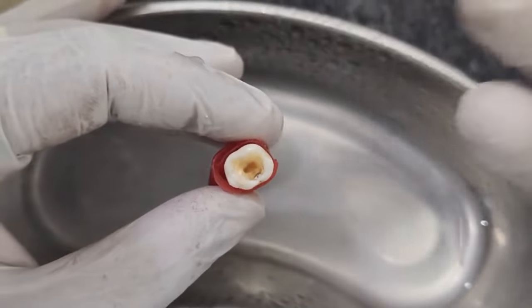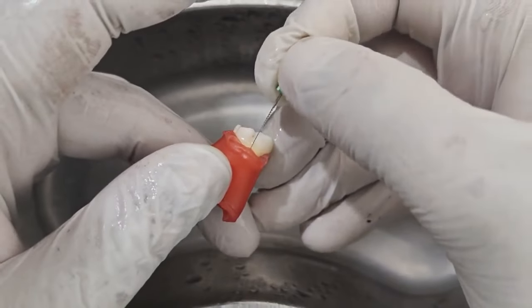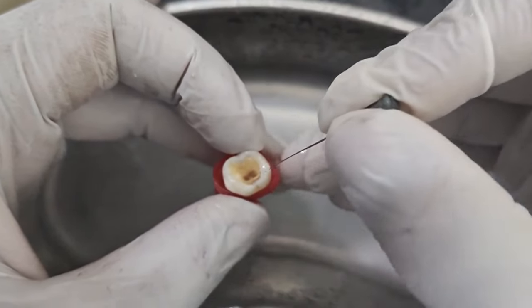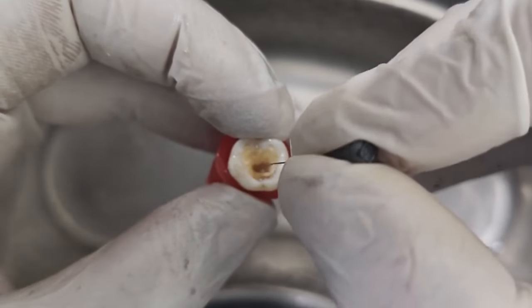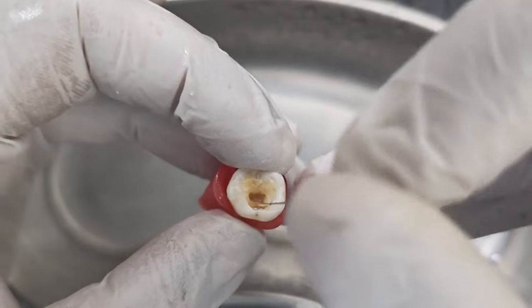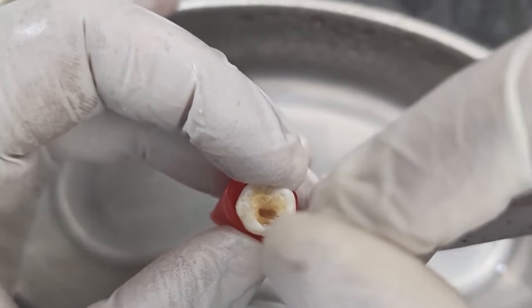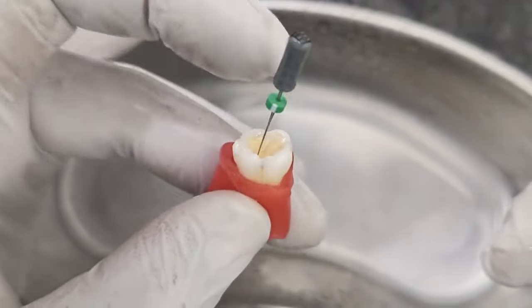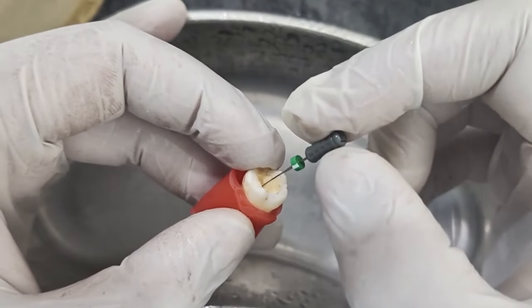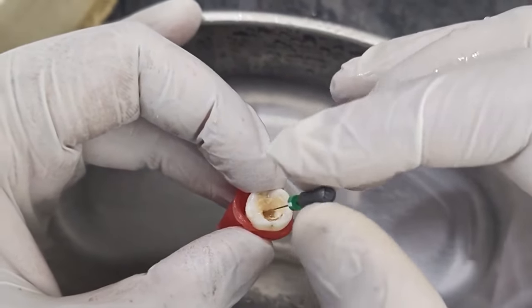So now you can see I have done the access opening of the lower molar tooth, and I will show you the level at which the canal is found. It's found exactly at the CEJ. Initially, now I am putting a number 8K file, and this is the distal canal. It's not going this side because you have the floor of the pulp chamber over here, so it will only go inside the canal. You should not push the file into the canal. Wherever it is going, you have to keep it till here only. You just have to see the patency of the canal, whether you have got the canal or not.